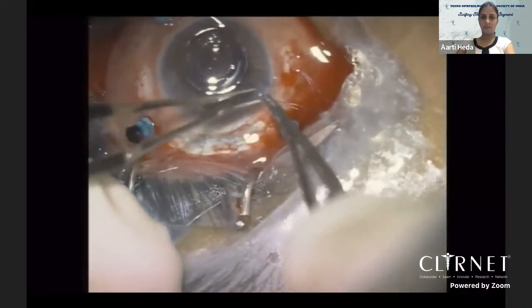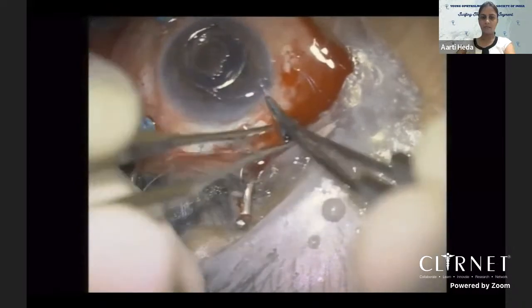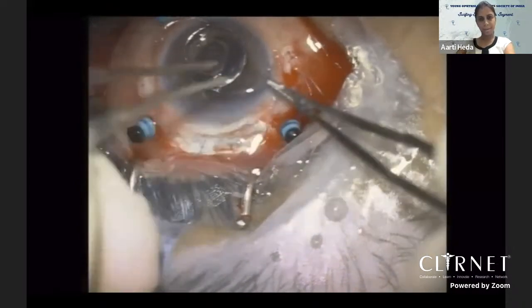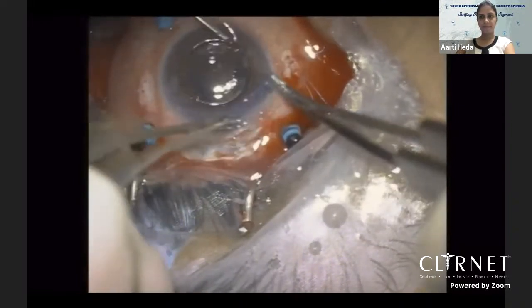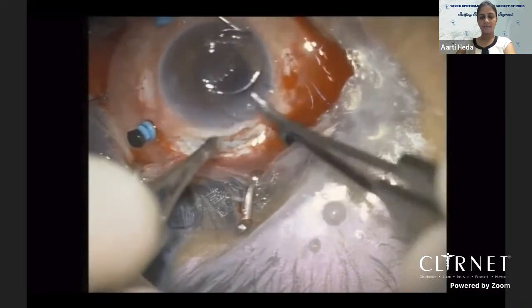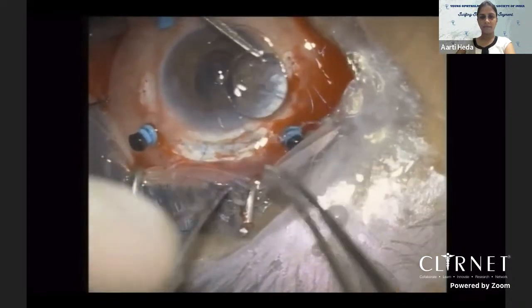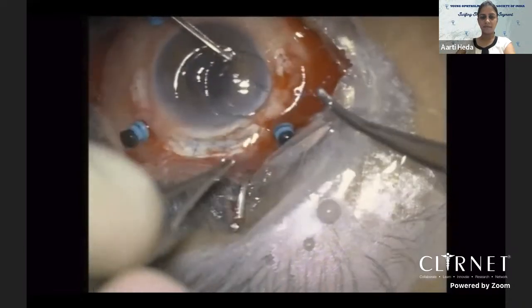So it's a PMMA IOL and has got eyelets in its haptics. We have to pass both the sutures from each side through the eyelets and tie them carefully. And it's really important to tie these sutures really well. Otherwise, post-operatively, we can see some wobbling of the IOL.